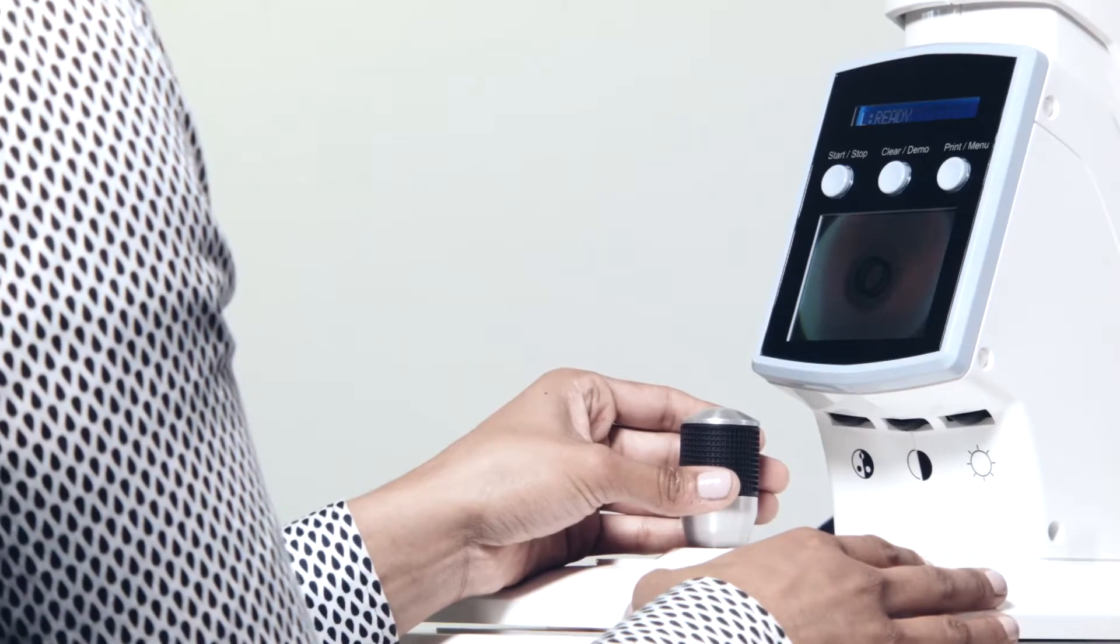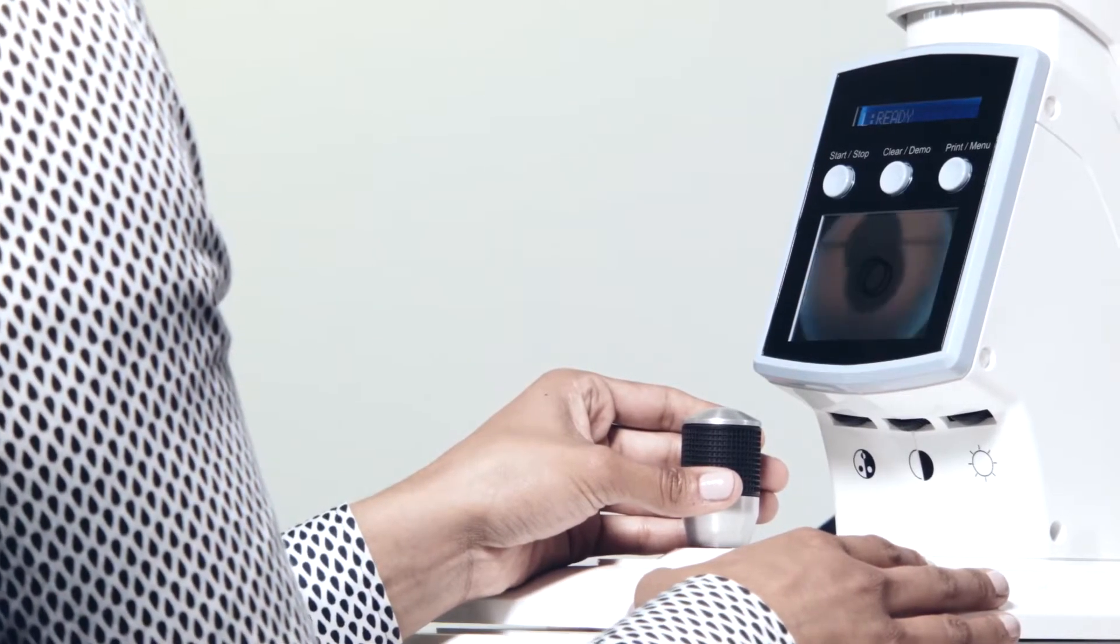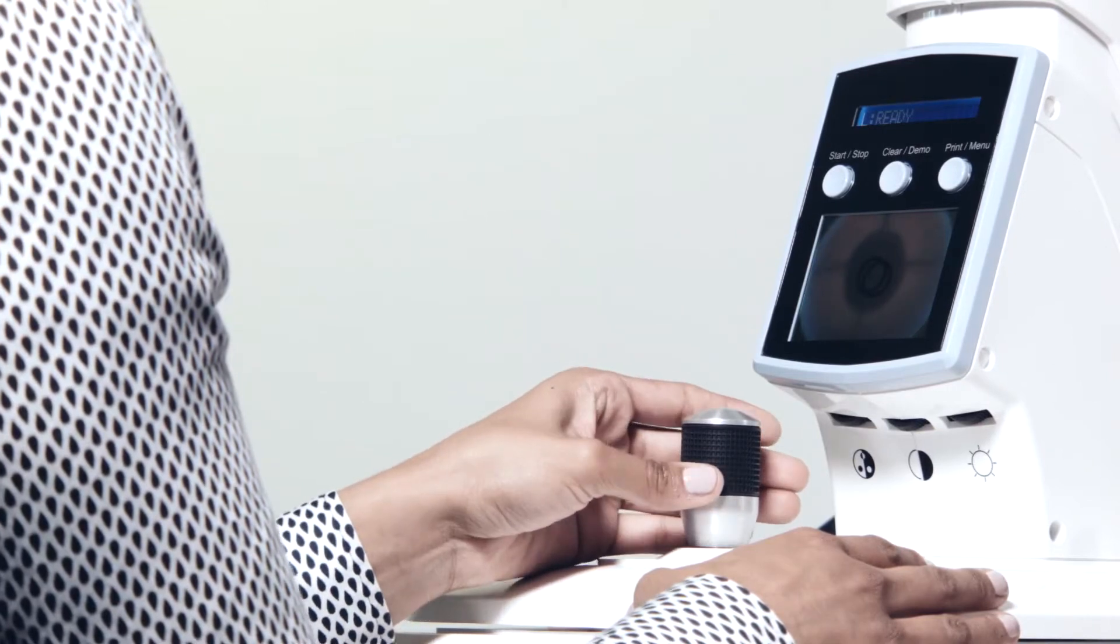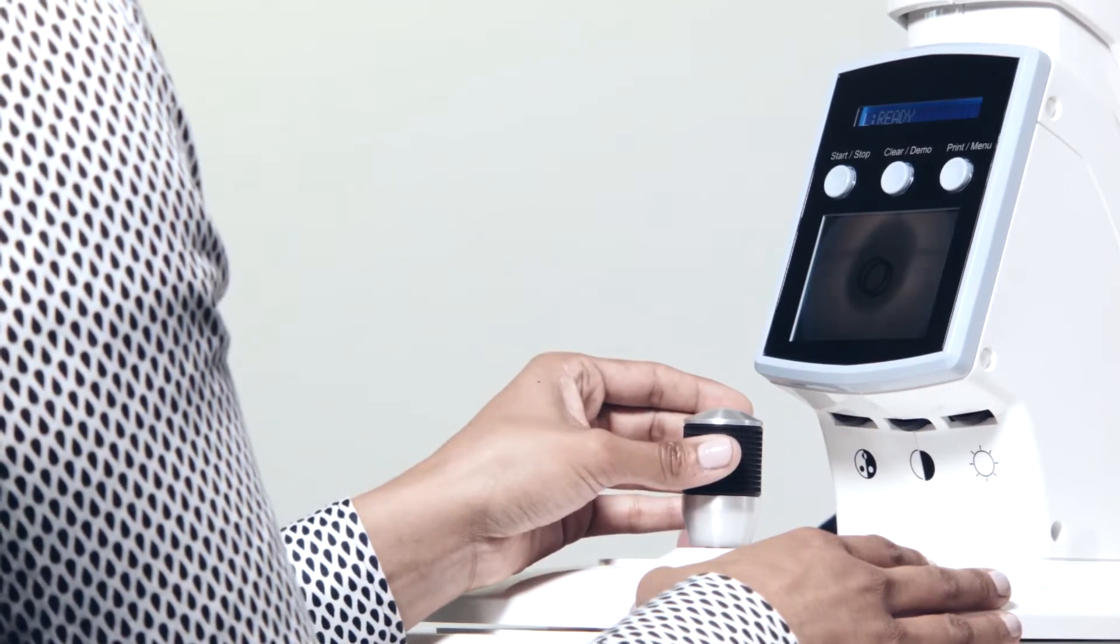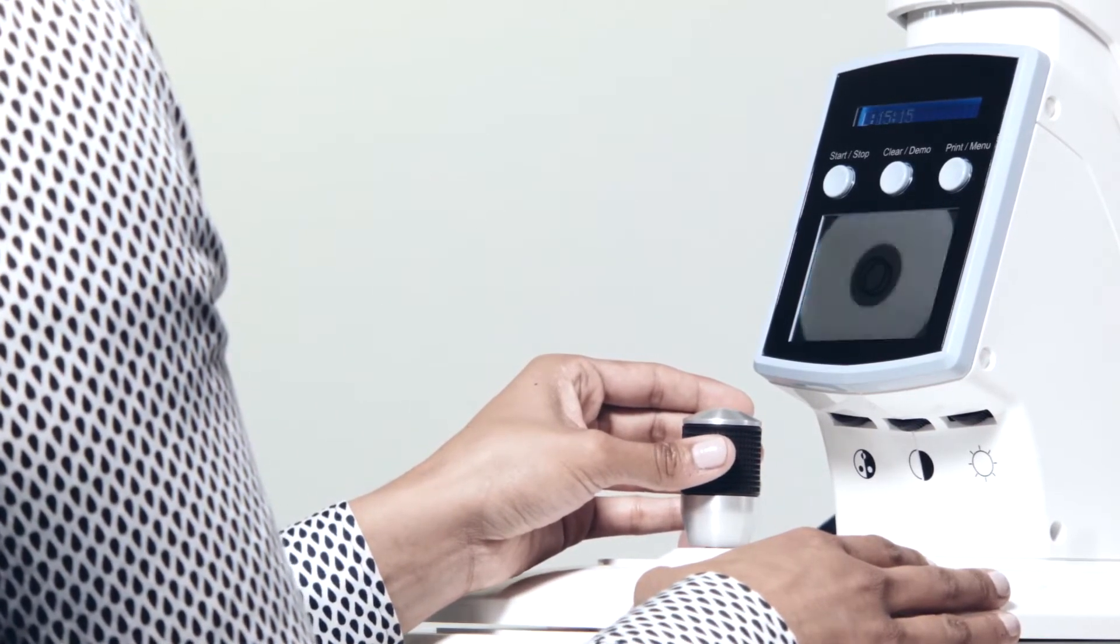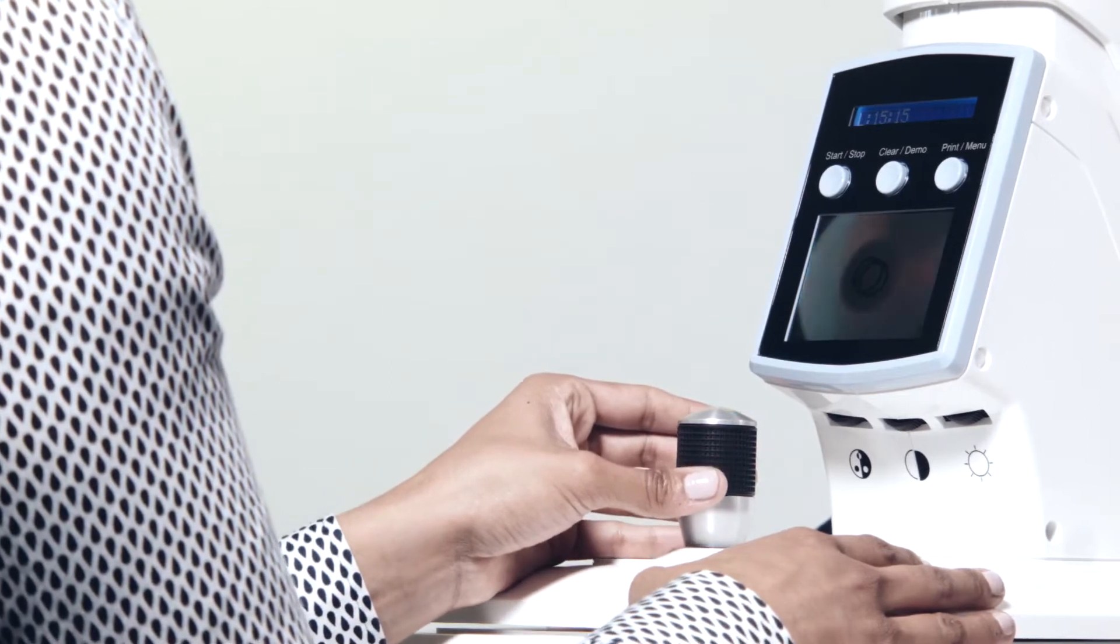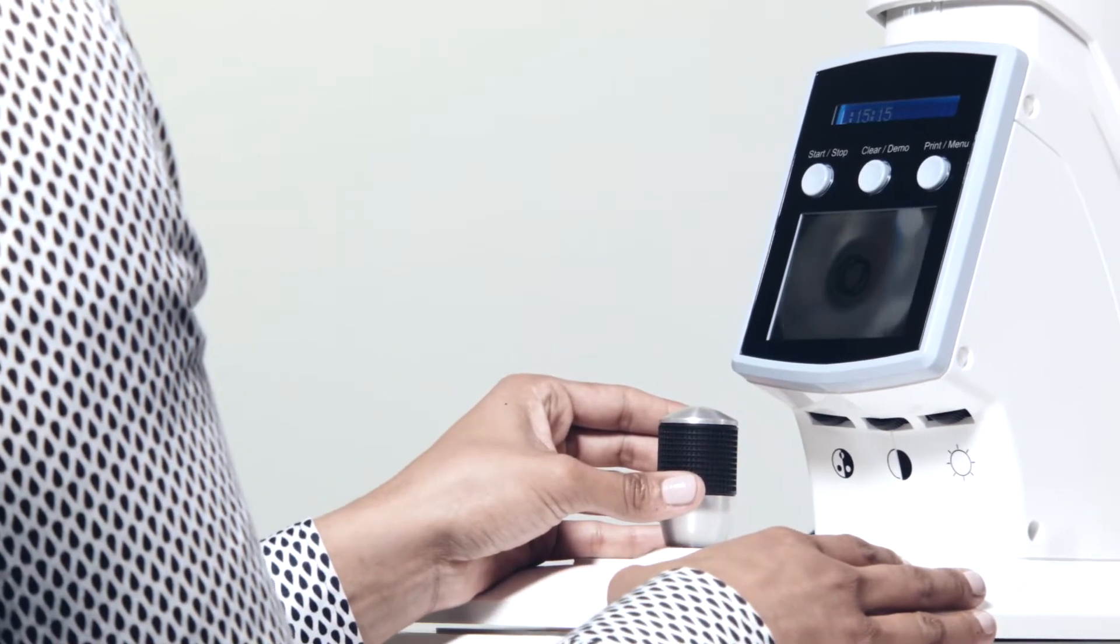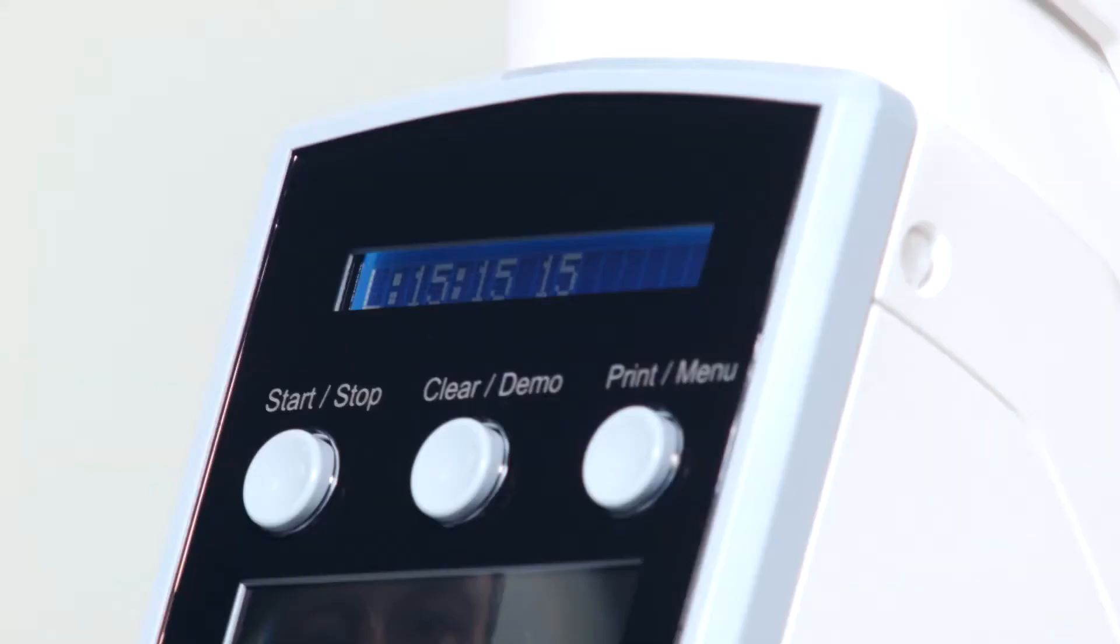To start a measurement, use the joystick to move the PulseAir desktop to a position to measure the right eye first. The PulseAir measures intraocular pressure by automatically releasing a puff of air into the cornea.